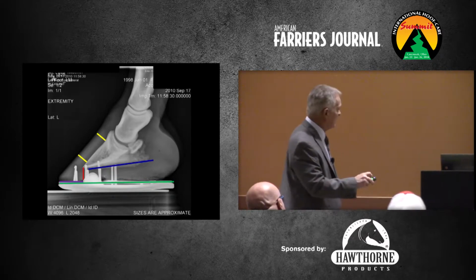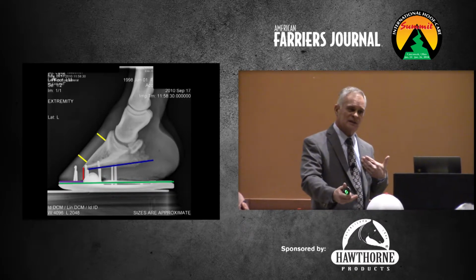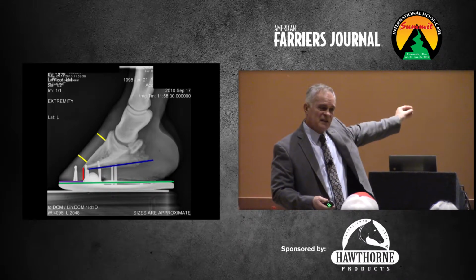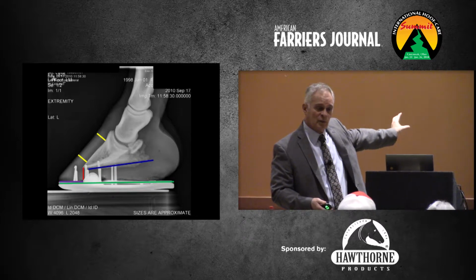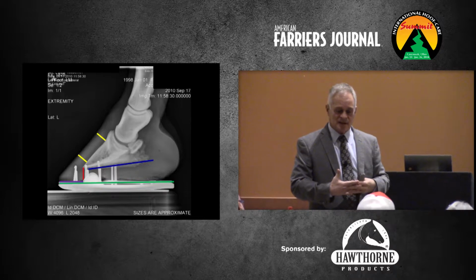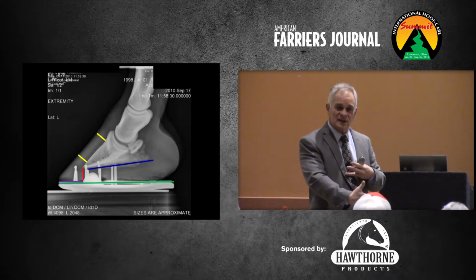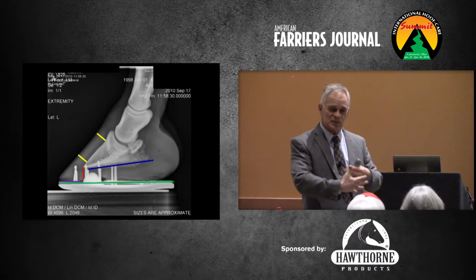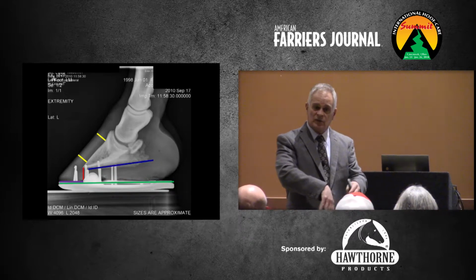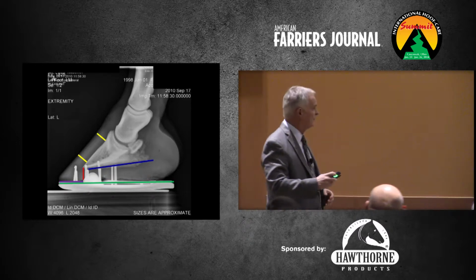Okay. Now sometimes we'll actually use those measurements, particularly changes or enlargements, with our laminitis cases. There's a fair amount of variation in individual horses in what those normal distances are. But what we know, for example, is that when a horse gets laminar swelling, or edema in the lamellar region, that distance would increase. That fluid pressure is pushing the bone away from the hoof wall. Or if they rotate or move, then the lower measurement's going to increase above the top one.